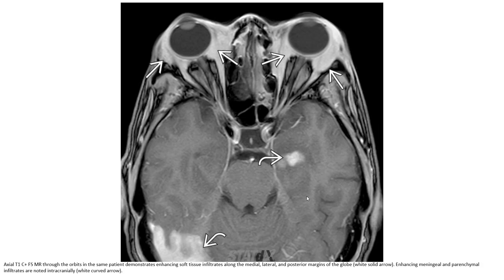The second case is Axial T1 C-plus MR, fat-saturated MR through the orbit in the same patient, demonstrating enhancement and infiltration along the medial, lateral, and posterior margin of the globe.